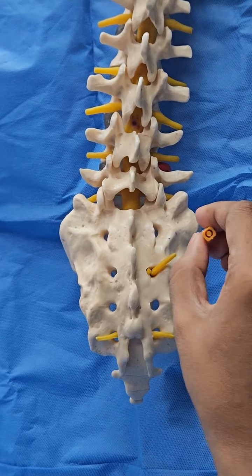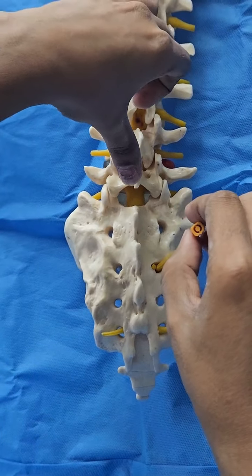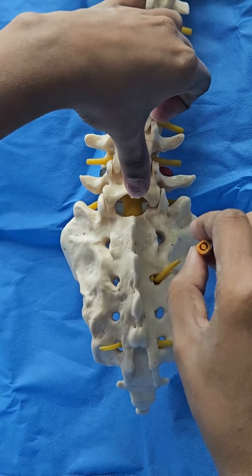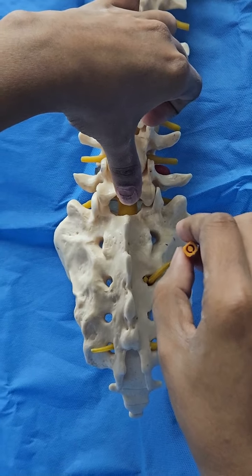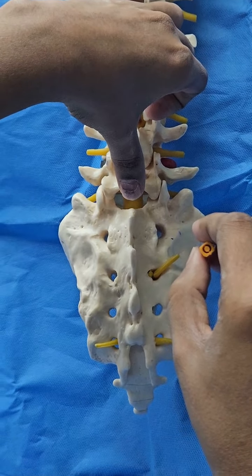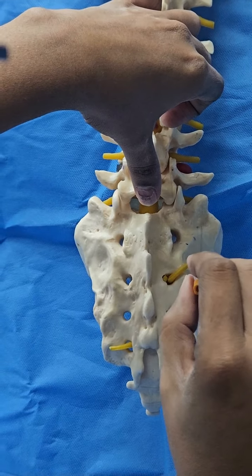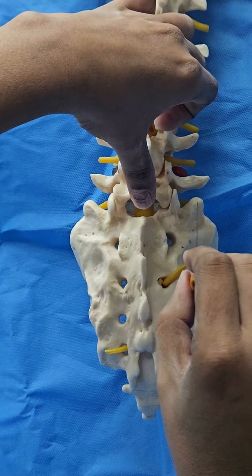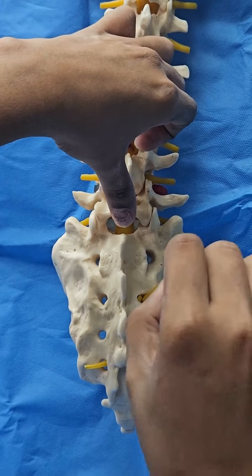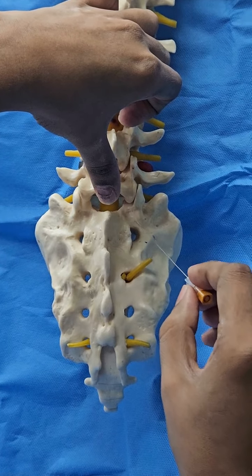From the point of entry, keep one hand to monitor the trajectory of the needle. Your needle should be directed toward the L5-S1 interspace. There are two components: first, you need to go cephalad, and second, you need to go medial. So from the point of entry, you angle cephalad and medial, then you enter.